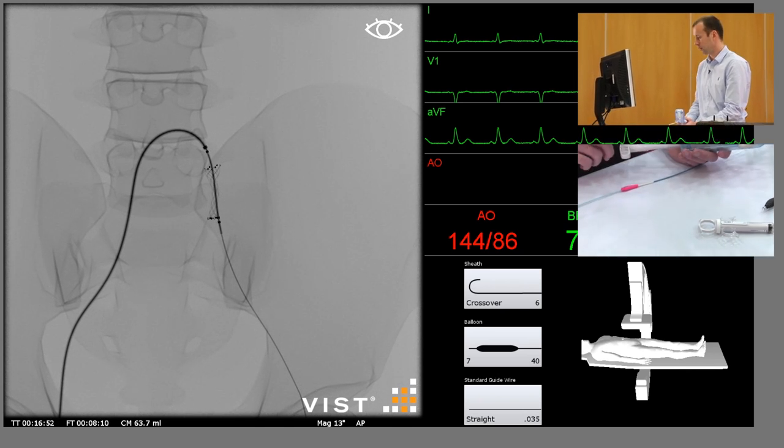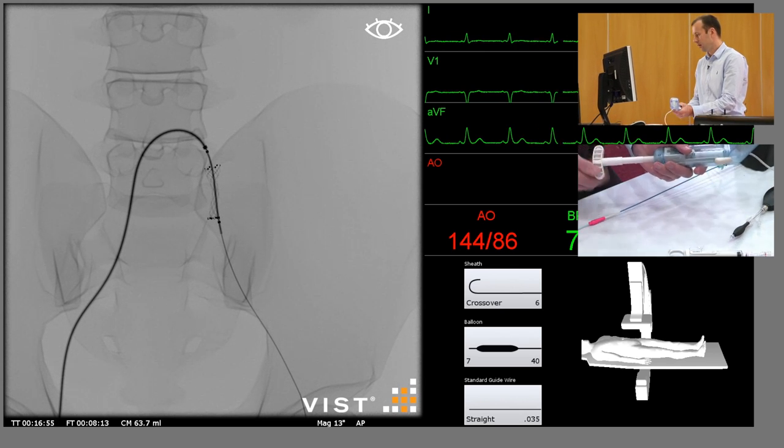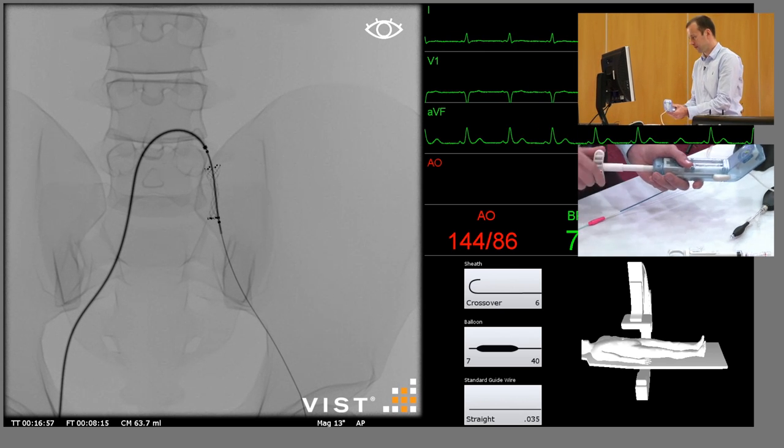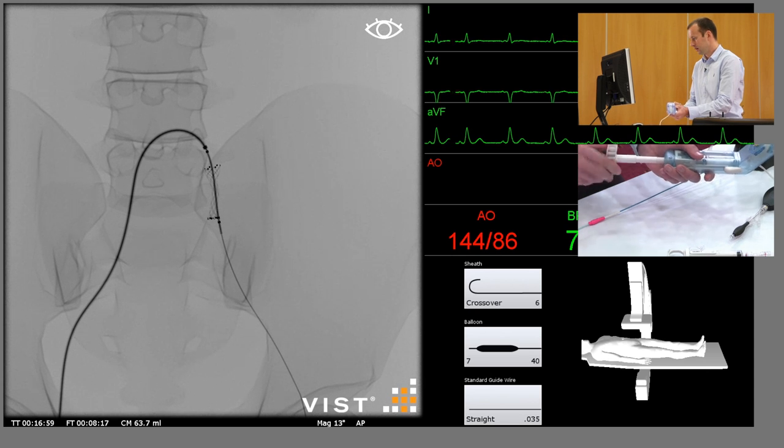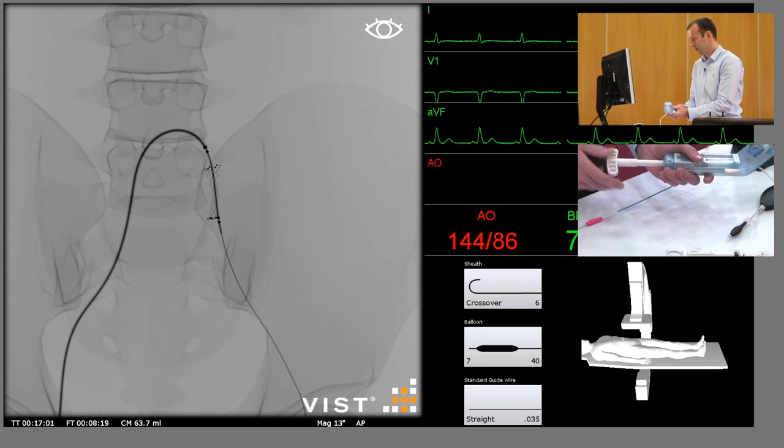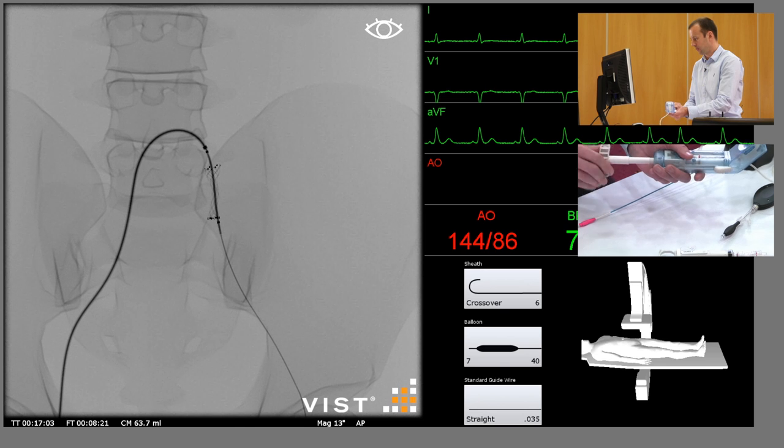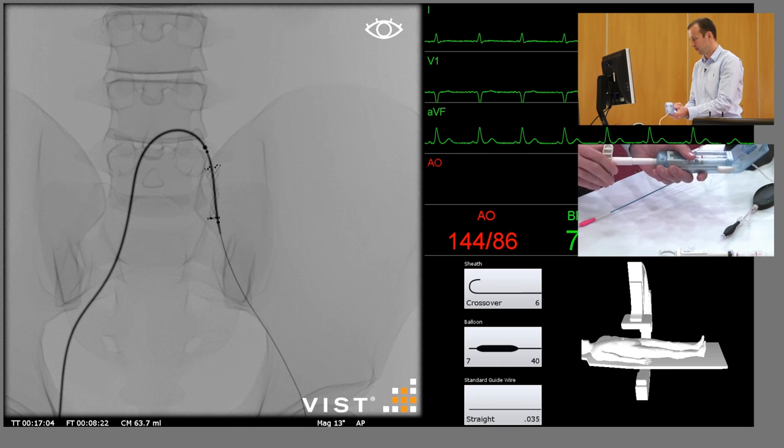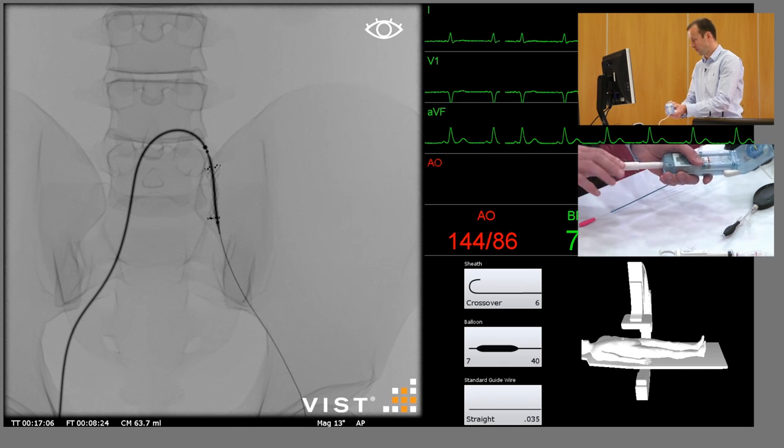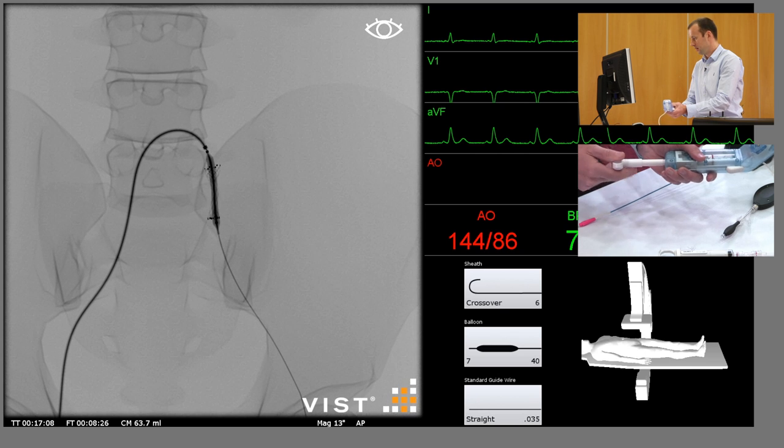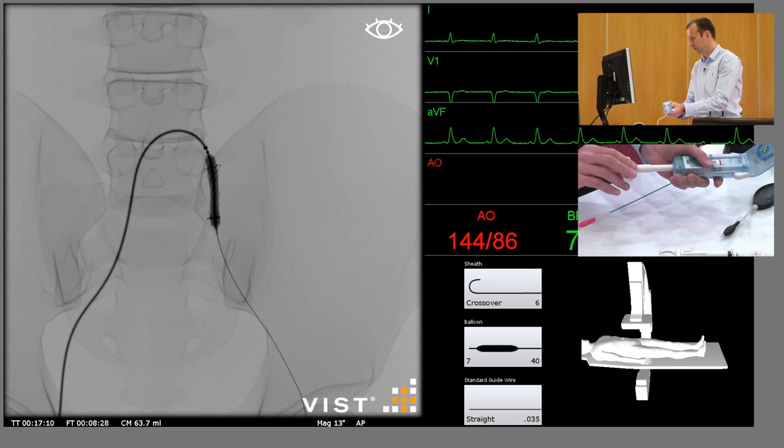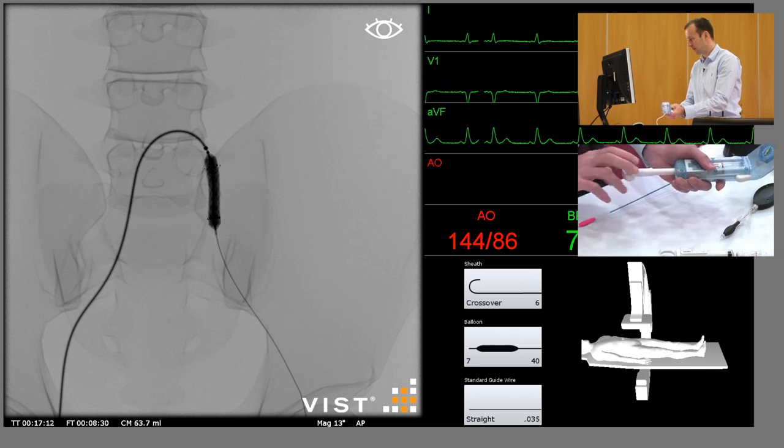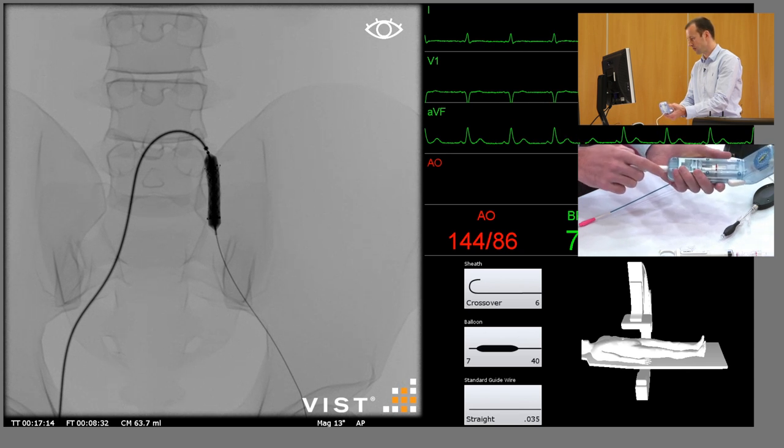We don't want to take the balloon into the external iliac artery, and we're close to the bifurcation, so we need to be careful. But then inflate the balloon until we see the waste disappear on the stent. But we're also guided by the patient, and if they start to experience pain, then proceed very carefully. This can be a sign of impending rupture.